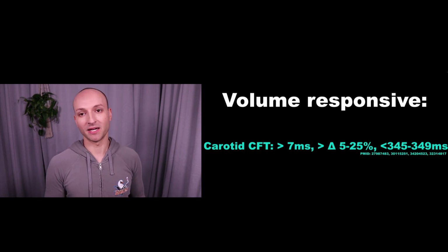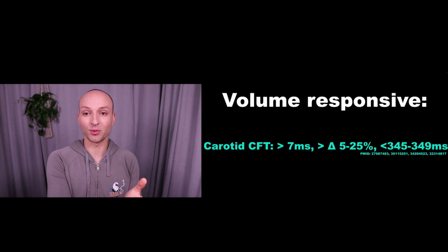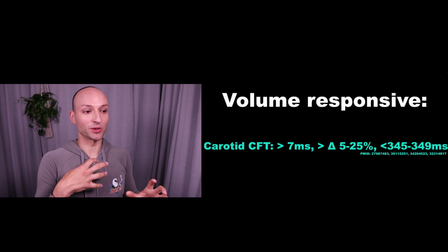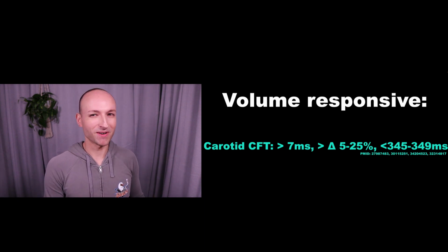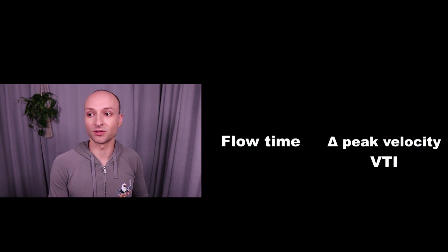But this is crazy, right? I mean, what if you were just a little off, like a little tick mark off? It might be the difference between 360 milliseconds and 340 milliseconds, right? So using this, I'm excited to learn a little bit more about it, but I feel like the data here is honestly probably one of the weaker data points, but it is there and it is something that you can use in the right clinical setting.